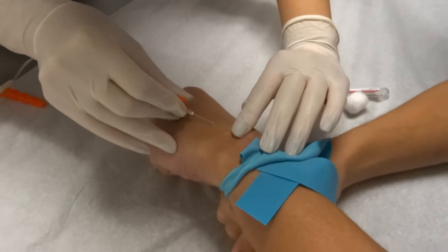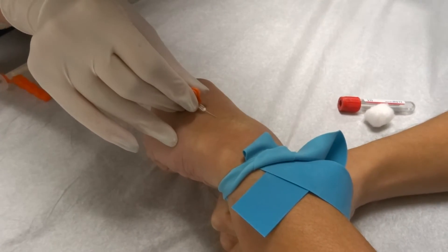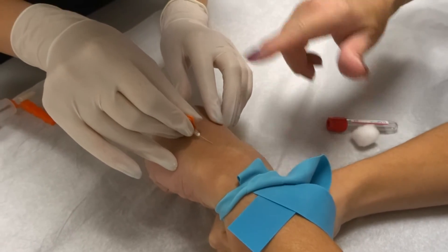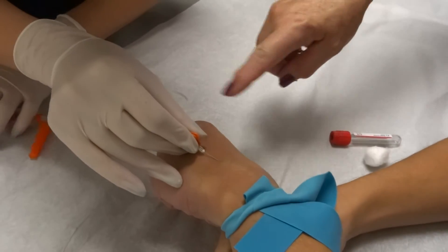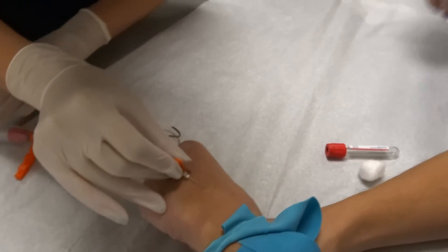Right here? Good. Looks like a nice angle. Touch it quick. Very good. I don't see a flash — you might be a little deep. Back out just a little bit. Let's engage your tube. Oh, there's your flash. You've got it. Nice.